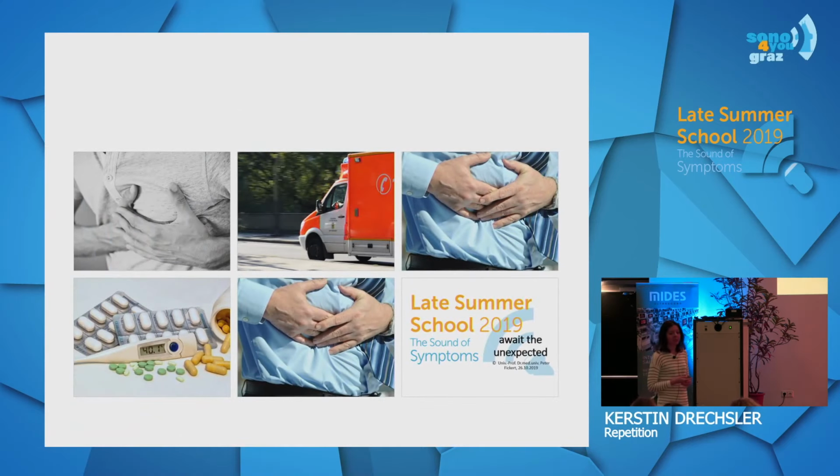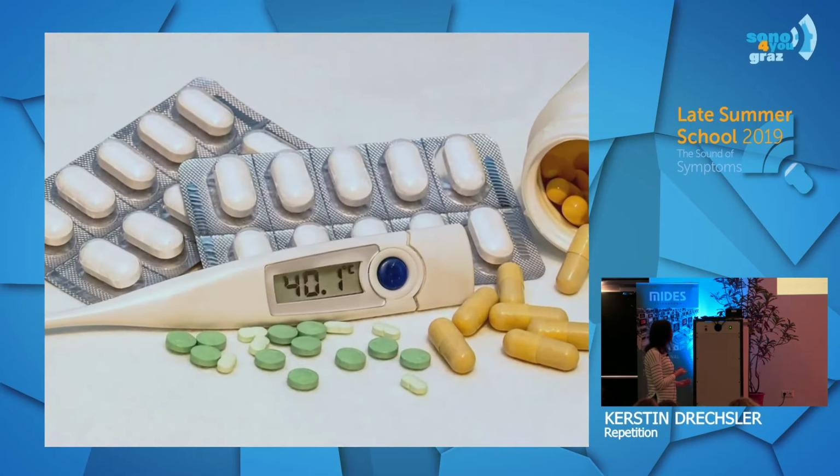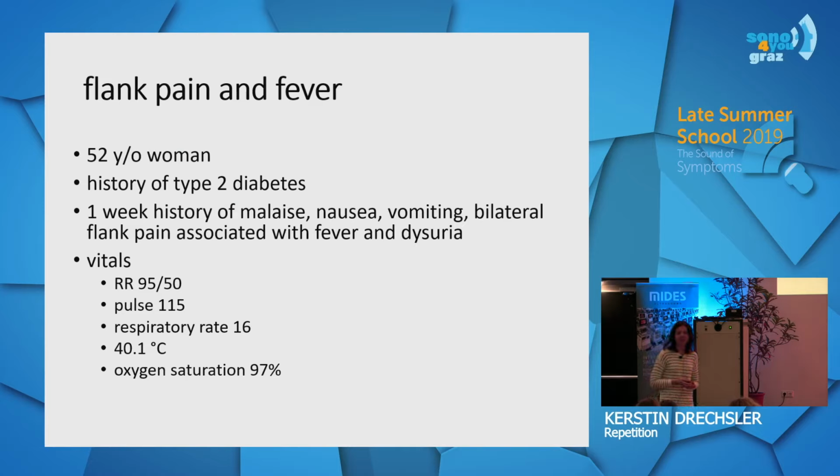We now move on to a diabetic patient. She is 52 years old. She has a history of malaise, nausea, vomiting, bilateral flank pain, and she has some fever and dysuria. At the moment of presentation, she presents with a 40.1 degrees Celsius fever and a respiratory rate of 16, and her blood pressure is relatively low. Her oxygen saturation is fine, and in clinical examination you notice flank pain bilaterally and some sort of abdominal distension.